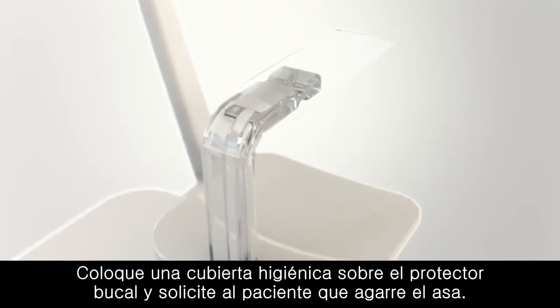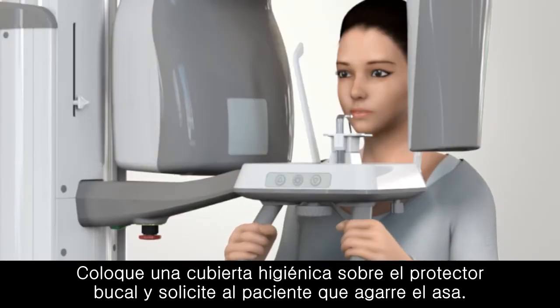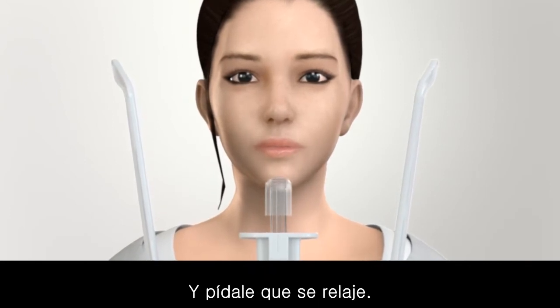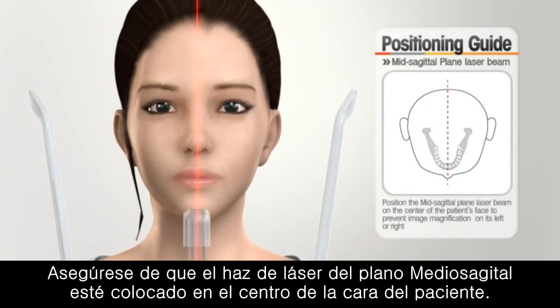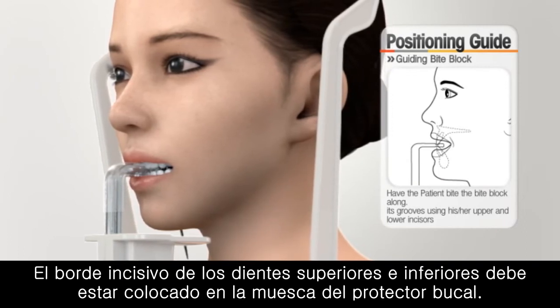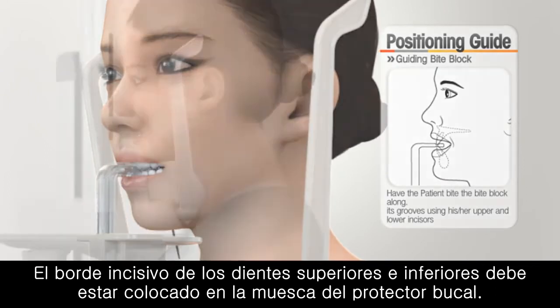Place a hygienic cover over the bite block and ask the patient to grasp the handle. Confirm the patient's right and left shoulders are parallel and lead the patient to relax. Make sure that the mid-sagittal plane laser beam is positioned at the center of the patient's face. Ask the patient to bite the bite block. The incisor edge of the upper and lower teeth must be placed on the groove of the bite block.